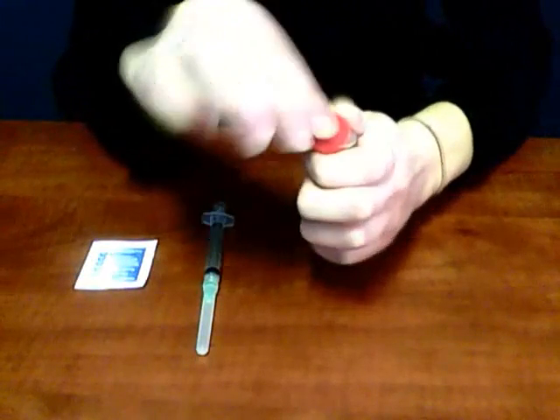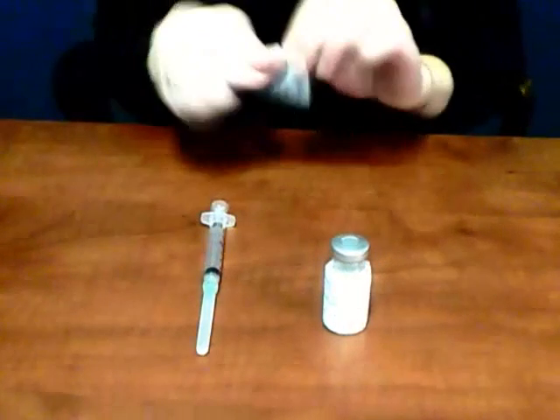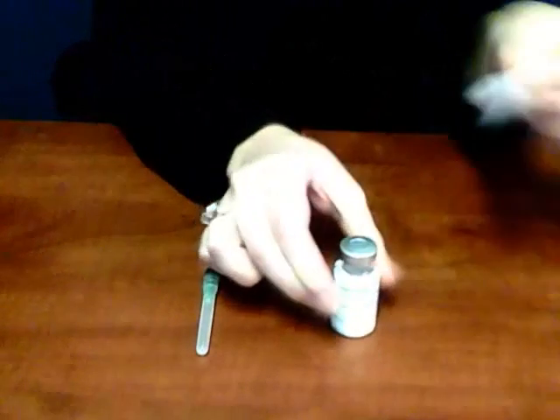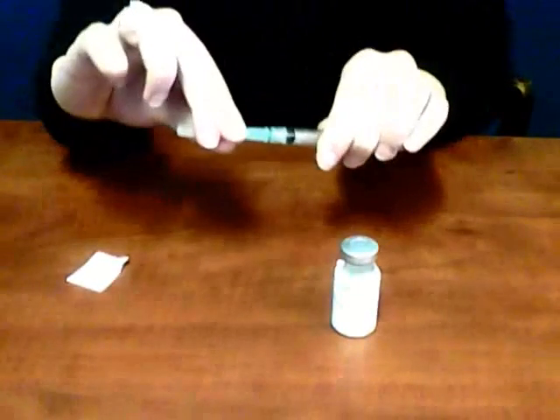Once you've cleaned off your surface and washed your hands, you can begin drawing up the medication. First, you need to pop the top off your injection vial with your thumb. Next, take an alcohol pad and wipe off the top of your vial. Make sure not to touch the vial after you've cleaned it, and allow it to dry for at least 10 seconds.